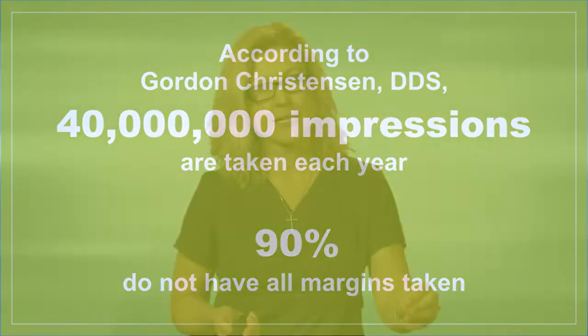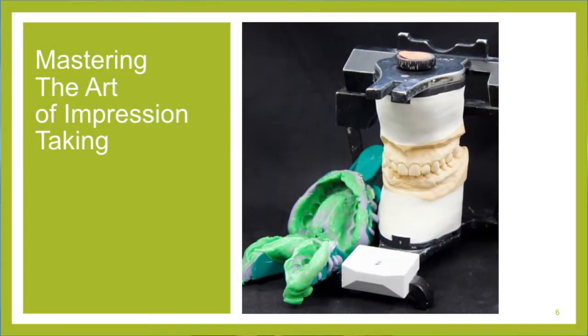And I love technicians. I work a lot with laboratory technicians, and they share with me some really bad impressions, and I've seen a lot out there. We're going to share some of those bad ones at the end of this module today. But if you don't know why these things happen and you don't understand how we can correct them, you're going to continue to have bad impressions. And most of the time, it's the operator, not the product.